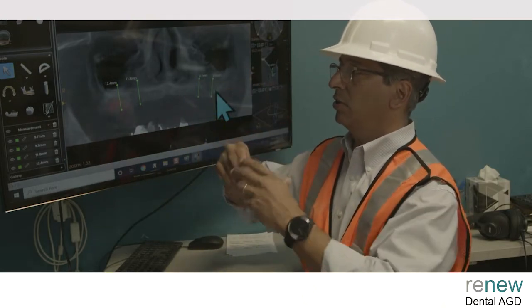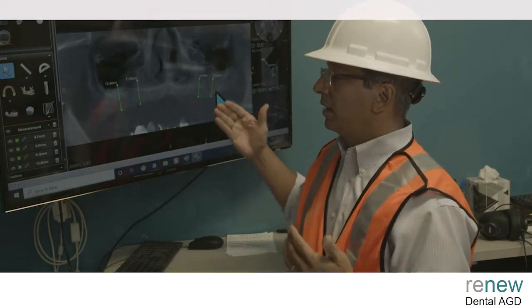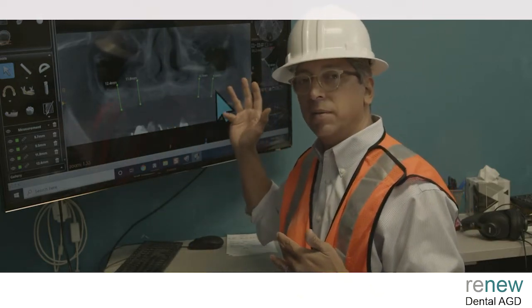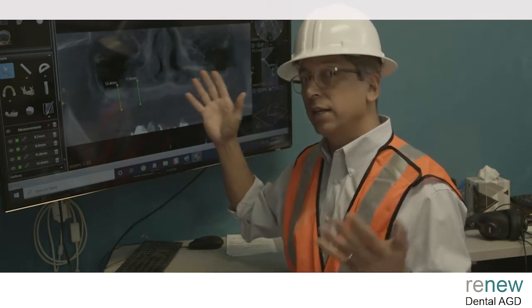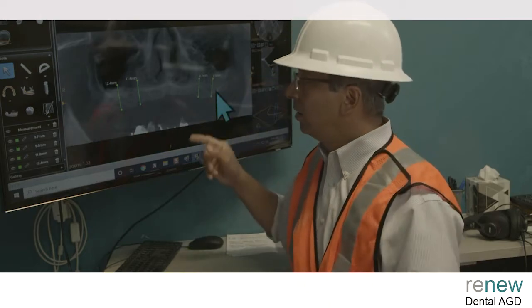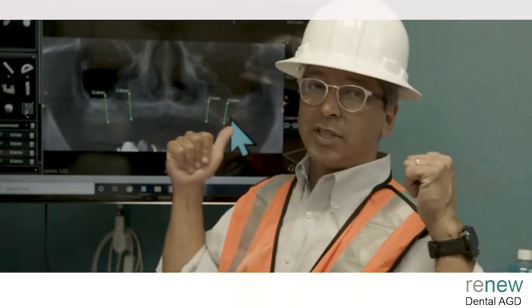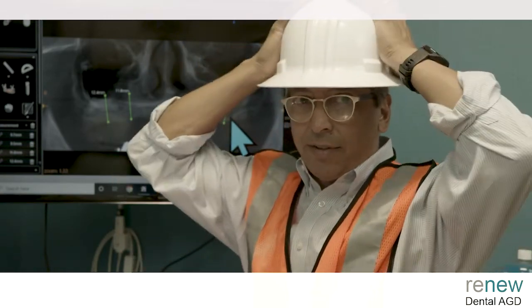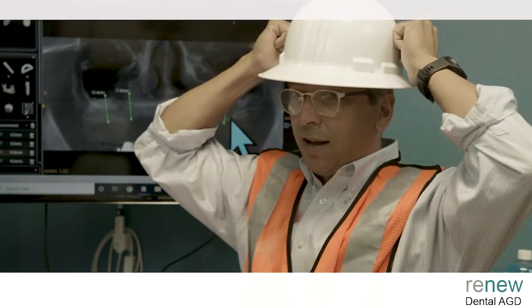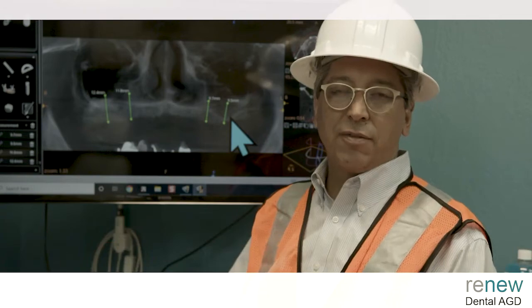If this works, okay, then you can do that. If this works, then you can do that. Like I said, an autogenous graft would probably be the best here. If you only have allograft materials or synthetics, then I guess that might work out okay too. But yeah, this is one of those cases that you've got to get your head, everything in place. You've got to get your hard hat on. You've got to get all your ducks in a row for this one.